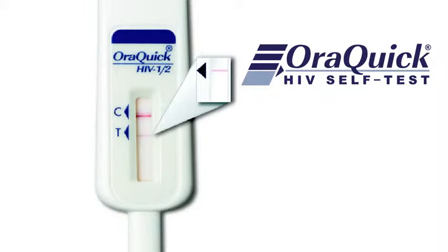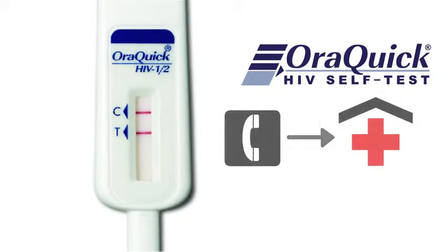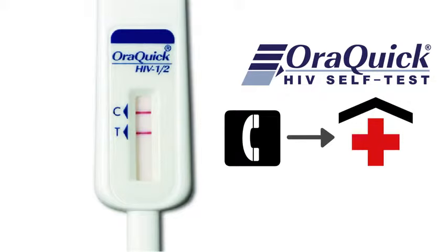If there are two lines — one next to the C and one next to the T, even if it's very faint — then you may have HIV. If your result shows two lines, you should contact your closest healthcare clinic or nurse. They will be able to perform follow-up tests and give you advice on what to do to stay healthy.